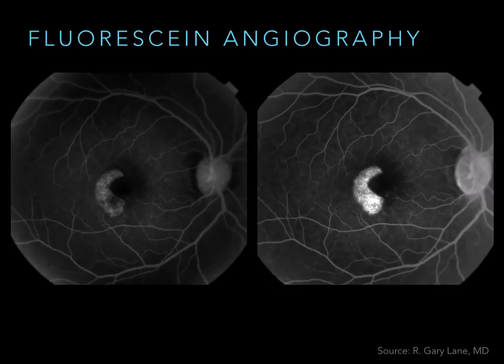So, when we talk about fluorescein, we usually want to talk about, are things abnormally bright or abnormally dark? When we talk about abnormally bright, we use the word hyperfluorescence. If they're abnormally dark, it's hypofluorescence. If I confuse those, I apologize. In this case, we got something hyper. I've got an early and a late. Early's on the left, late's on the right. And you want to characterize it. What type of hyperfluorescence is this? Is this staining? Is this pooling? Is this leakage?